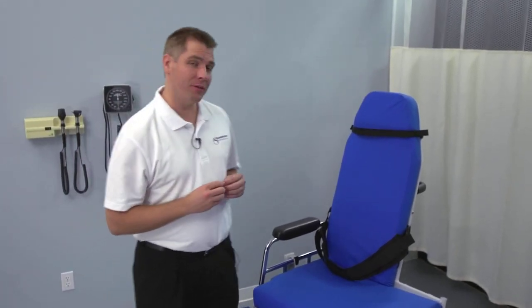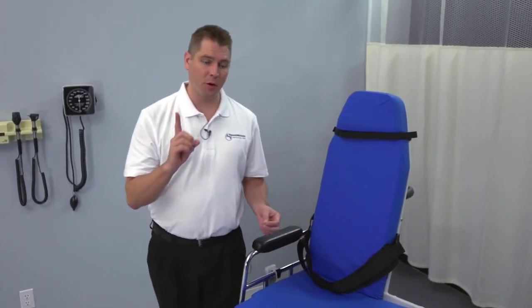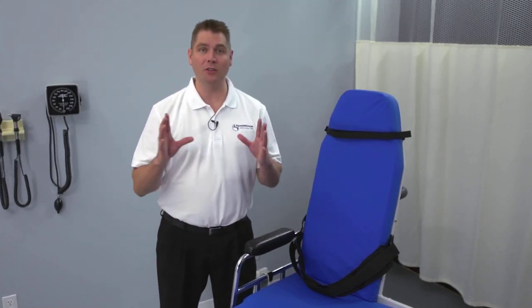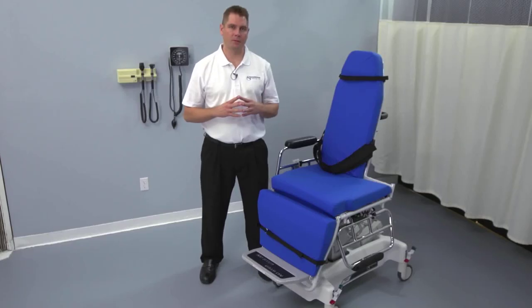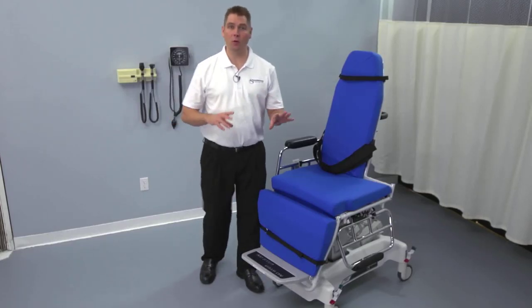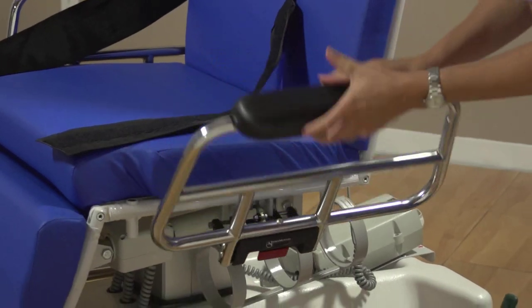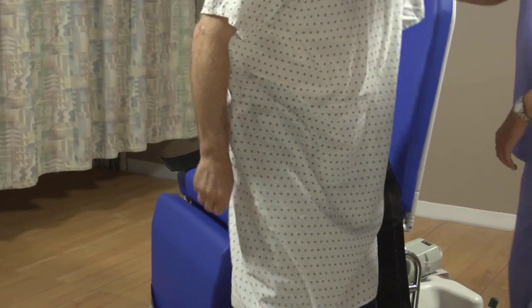Now let's take a look at how you will want to take a patient in and out of the chair. For safety's sake, make sure they always enter and exit from the side. First, you'll need to lower the cushion side rails. These rails are designed so that you can operate them easily, but a patient cannot. Lowering the rail requires two actions simultaneously: push the rail in, and at the same time, pull the red lever out. The rails retract and lock beneath the seat.